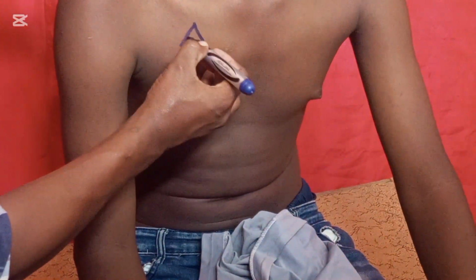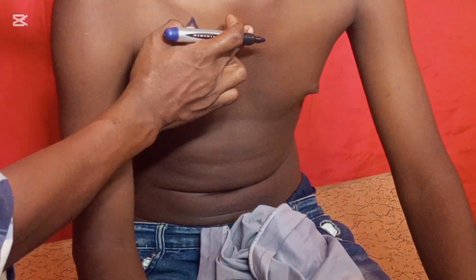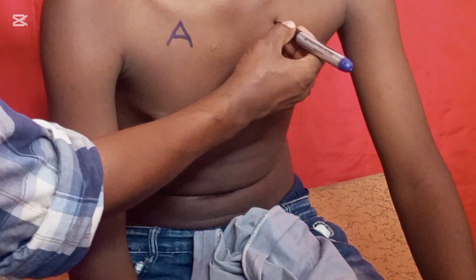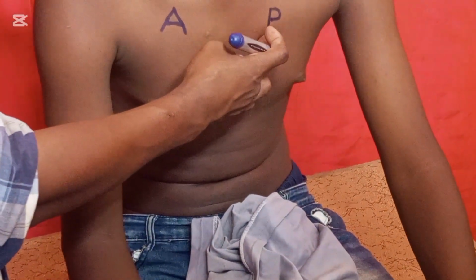Here is the aortic valve. Then we move directly into the second intercostal space on the left side of the sternum. This is where we find the pulmonic valve.